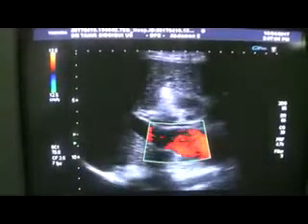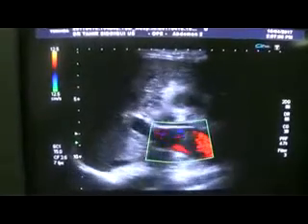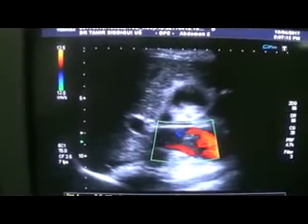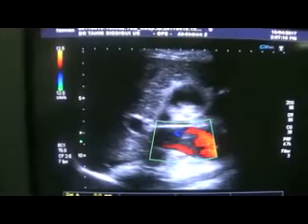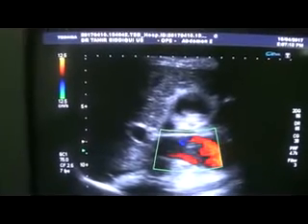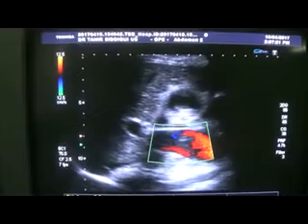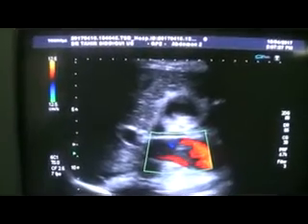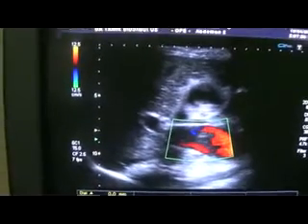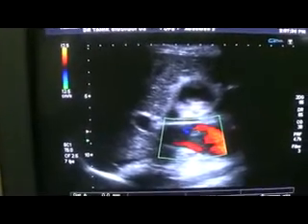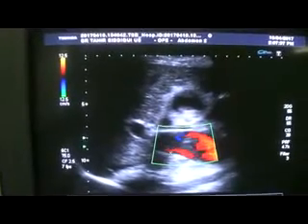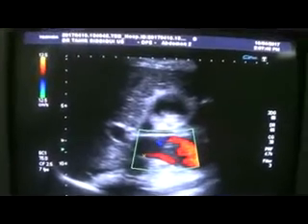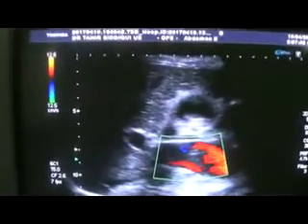Now you see that the blood flow goes anterior to the portal vein. This is the portal vein, this is the clot — this white area. The portal vein in its extrahepatic part, as it enters the liver, we see that the supply is cut off in the region of the clot. Though the clot is non-obstructive, it's not completely obstructing the lumen of the portal vein. That's the reason we can see blood flow anterior and posterior to this clot within the portal vein.